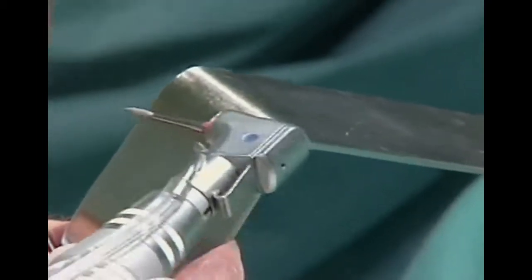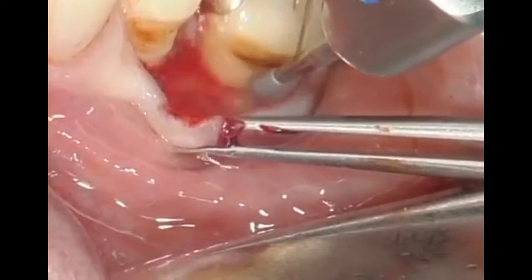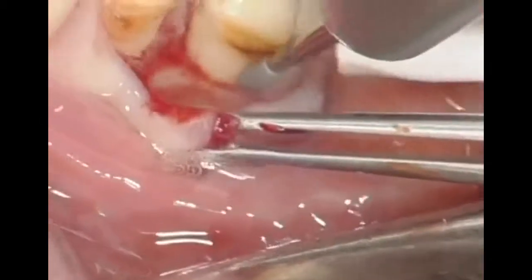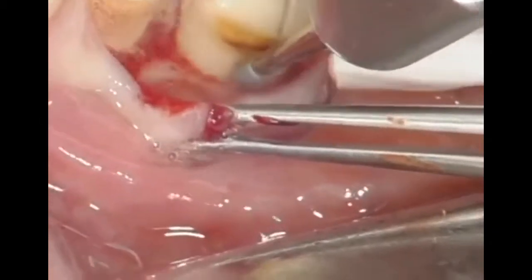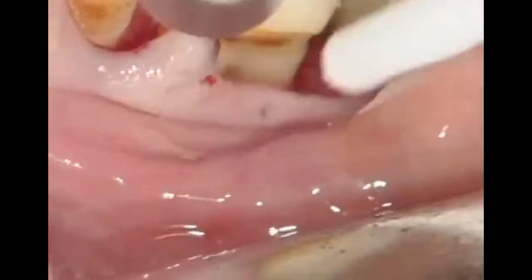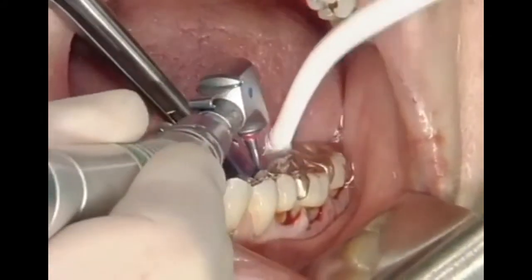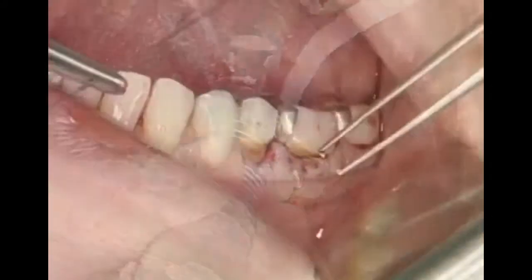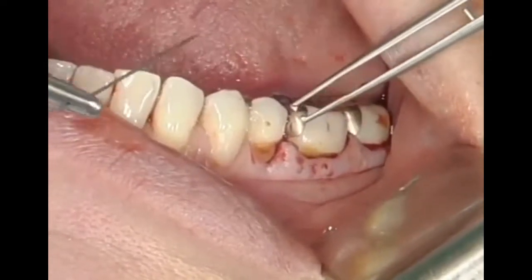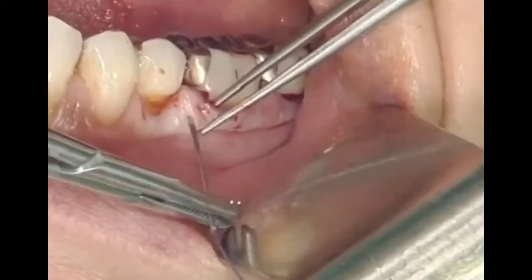A perio mill is used to remove all plaque and calculus. Any impurity would endanger the successful treatment with Emdogain. Pre-suturing the soft tissue around the defect will help in closing the final flap.